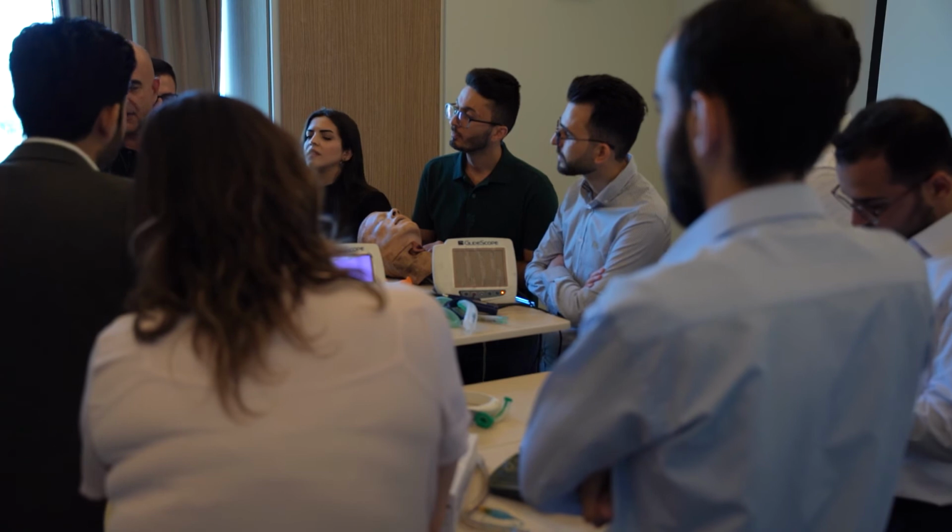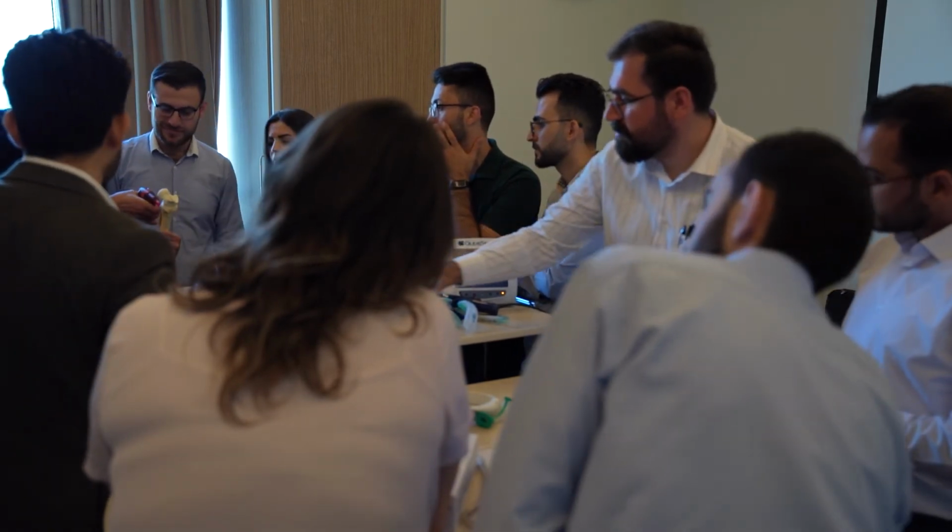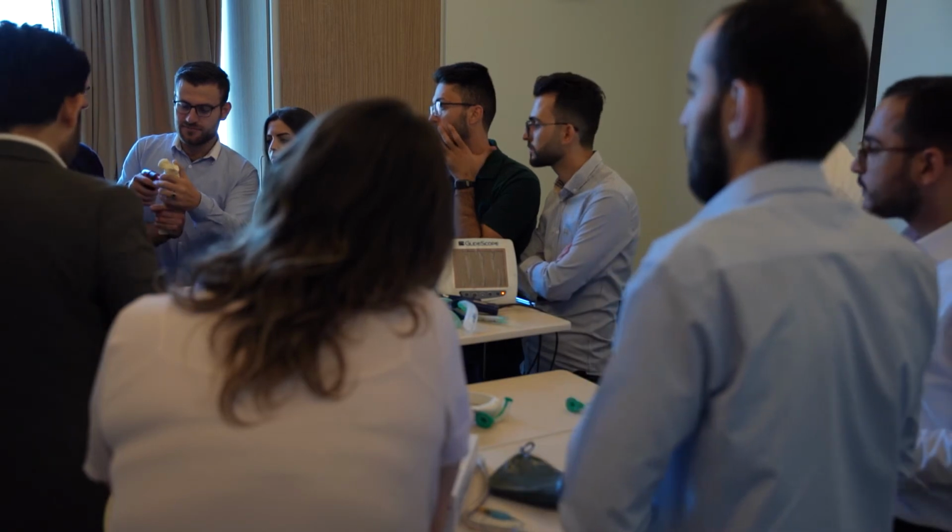The ideal way is the anteromedial part of the upper tibia, just 2 fingers or 2 centimeters below the tibial tuberosity. You are going to pierce the soft tissue, okay? And hold like that.